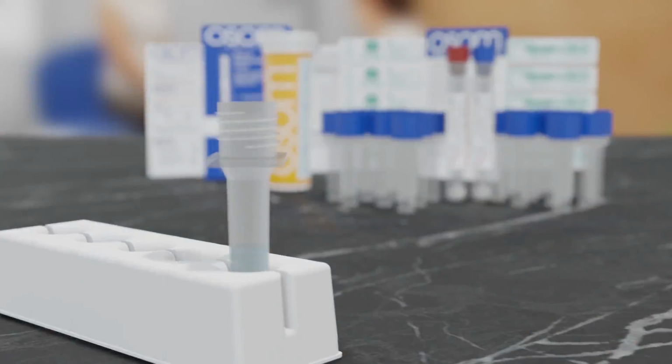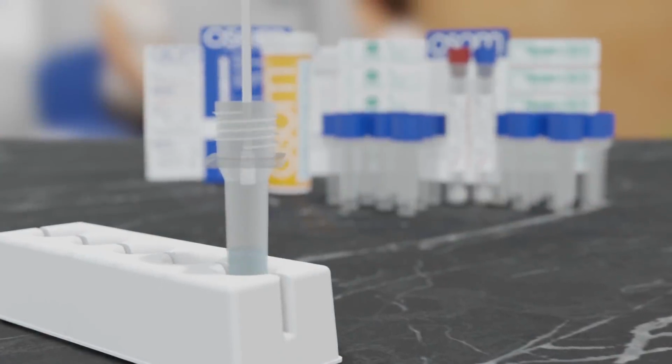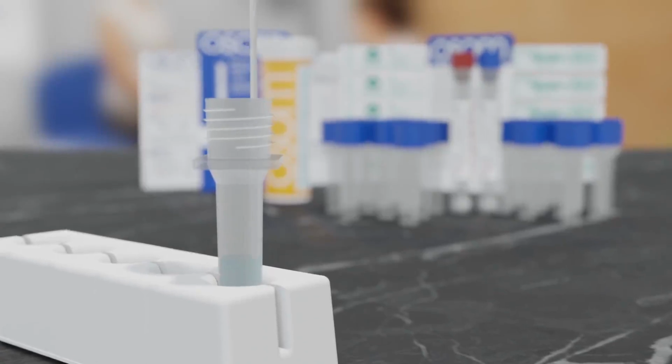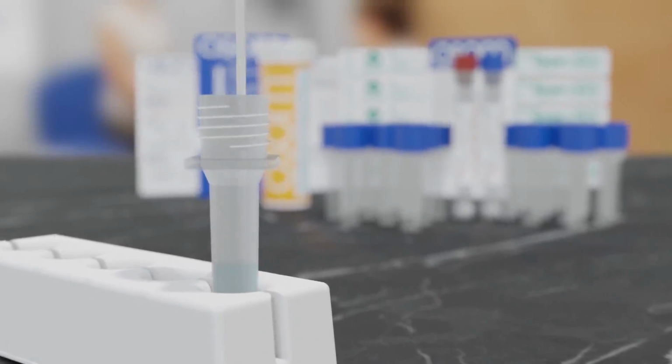Test procedure. Twist cap off buffer vial. Insert the swab through the ridges into the liquid. Mix thoroughly by spinning the swab at least 10 times in the liquid.